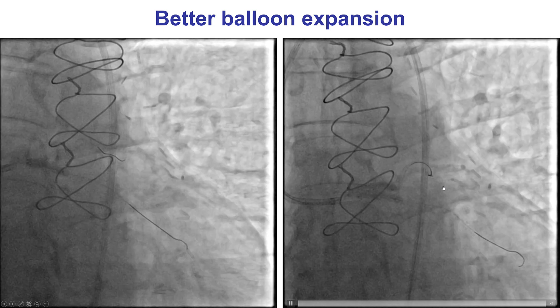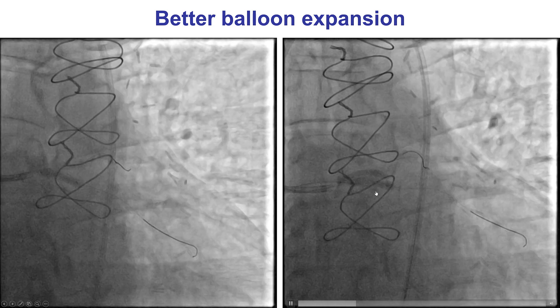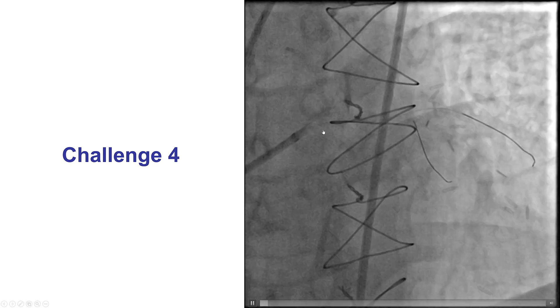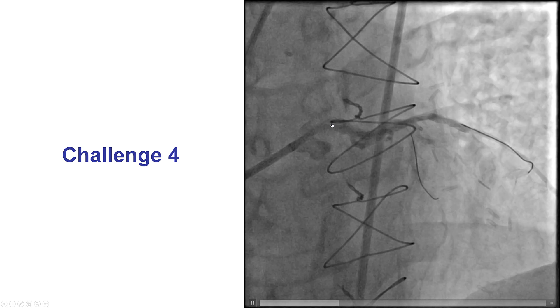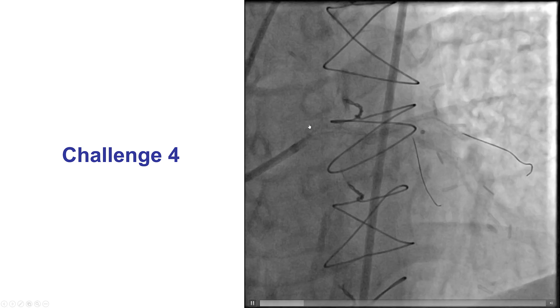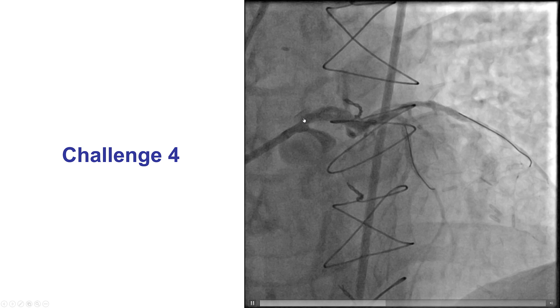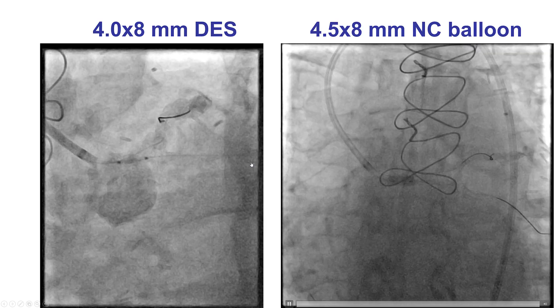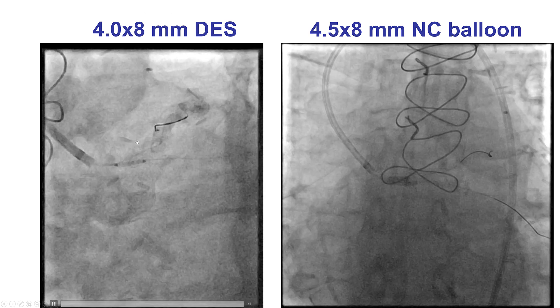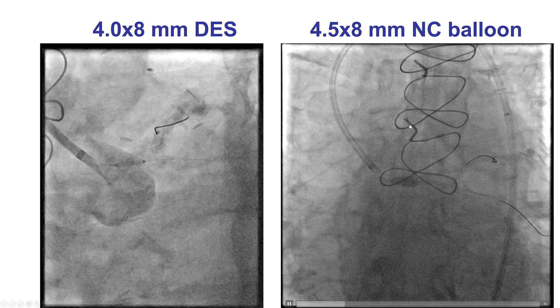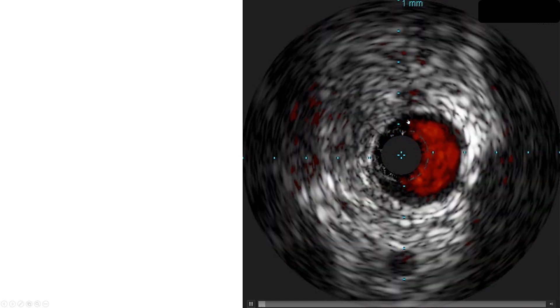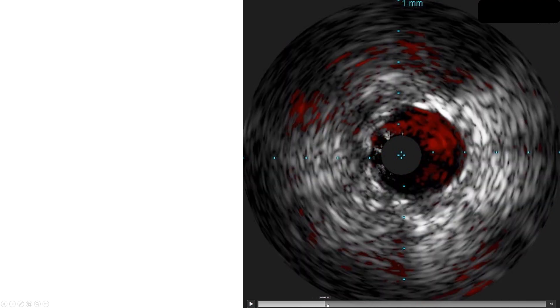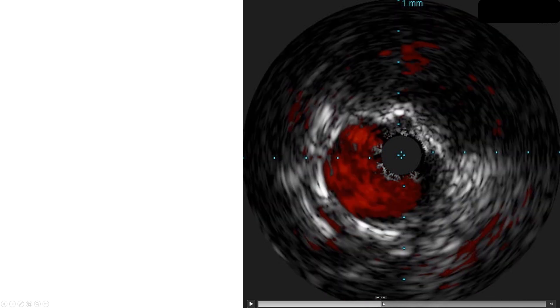After doing that, we were actually able to finally expand the balloon into the circumflex. Of course, more problems arose. We did have a proximal edge dissection — a left main dissection, likely from the high-pressure balloon inflations. So this was treated by placing an additional 4.0 by 8 mm Xience drug-eluting stent, taken up to 4.5 with an 8 mm non-compliant balloon. We performed intravascular ultrasound to check our result and confirm that there was good expansion of the stent, which was the case.